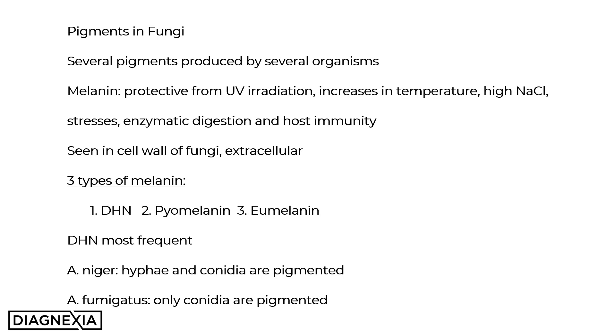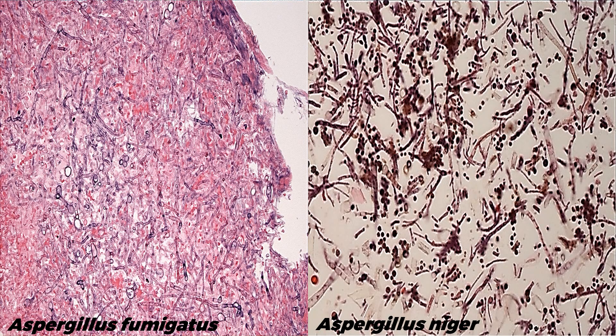The melanin distribution is different between Aspergillus niger and Aspergillus fumigatus. In Aspergillus niger, both the hyphae as well as the conidia are pigmented, whilst in Aspergillus fumigatus only the conidia are pigmented. Here is a side-by-side comparison of the two species. Clearly the Aspergillus niger on the right is characteristically pigmented. However, the morphology of both can be seen to be very similar, with the hyphal forms showing septation as well as dichotomous branching at 45 degrees, most evident in the Aspergillus fumigatus example.